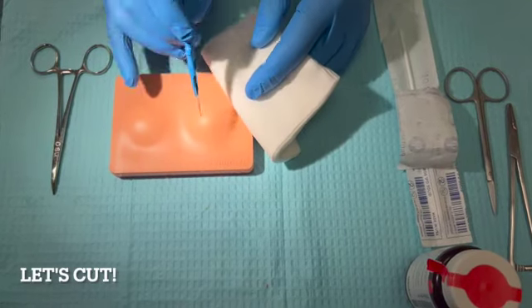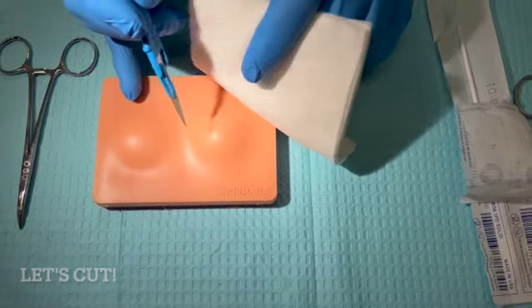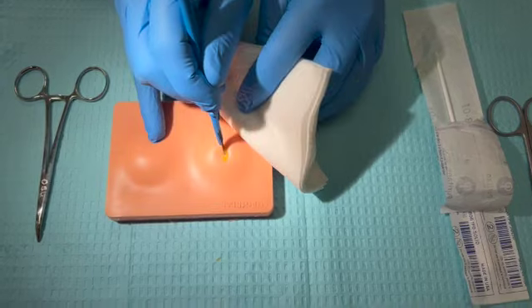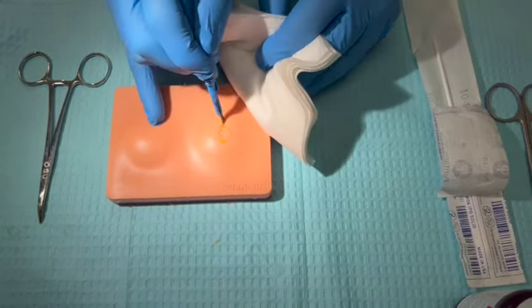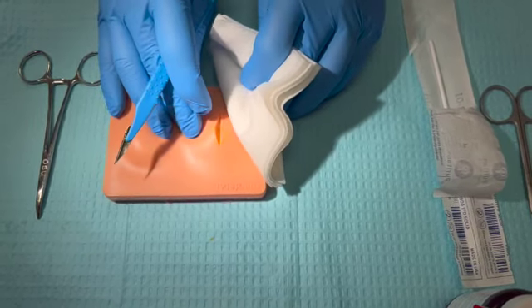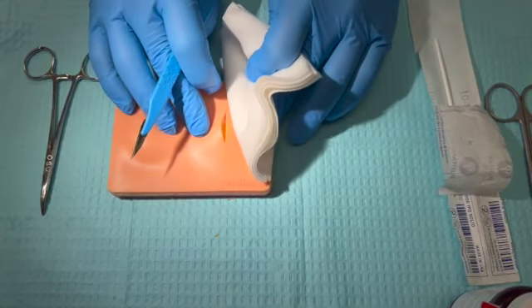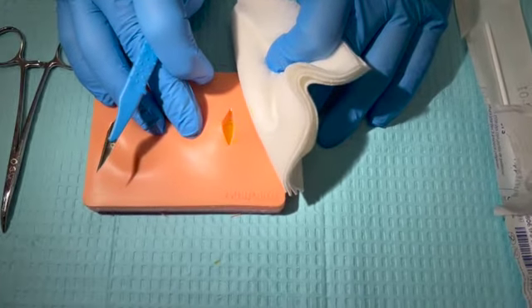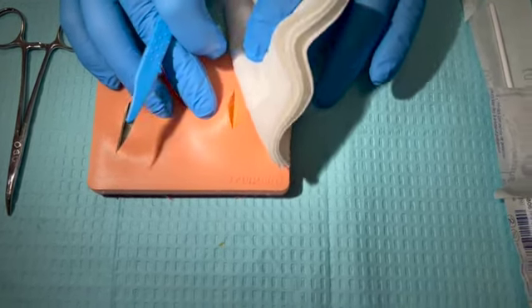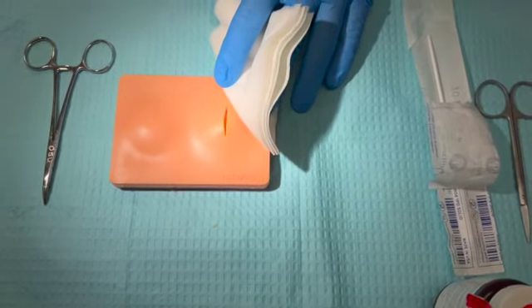Now we're ready to make our incision. I'm going to make the incision distal to proximal with reference to myself. And again, we want to make sure that it is into the area and that we are coming far enough along the entirety of that abscess, being prepared, making sure that we are comfortable with the length as well as how well we're able to gape that area out. This is an instance where at this point, nothing is draining from it. Typically, this will be ready to drain very rapidly. I'm going to go ahead and put my sharp away from me so that no injury is made.